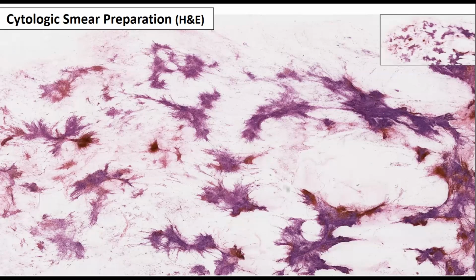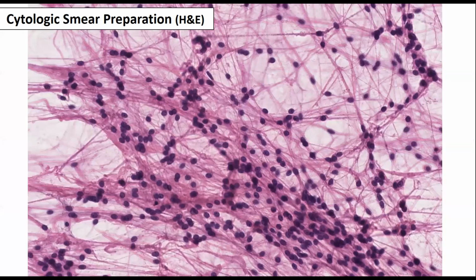But it also tells you that if there's tumor there, it's being tightly held by the tissue, and that can be informative. The second pattern is single cells, a beautiful smear of single cells, like in lymphoma, medulloblastoma, central neurocytoma. And then the third pattern, chunks, clumps, which is due to either intercellular junctions, desmosomes if you will, or long intertwined, intertangled cell processes like in a sarcoma or solitary fibrous tumor, or both, desmosomes and long cell processes like in meningioma. So this is definitely chunky, and here's the high power on the smear, and this is telling you volumes.